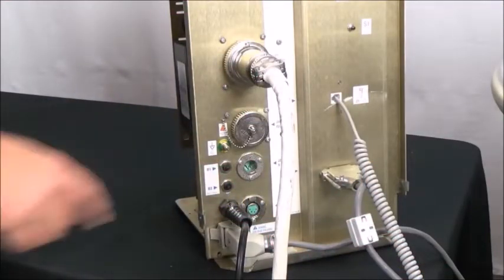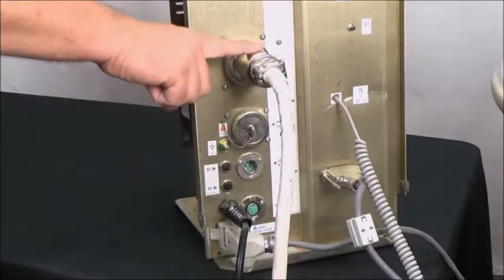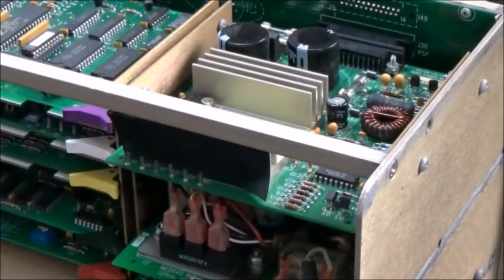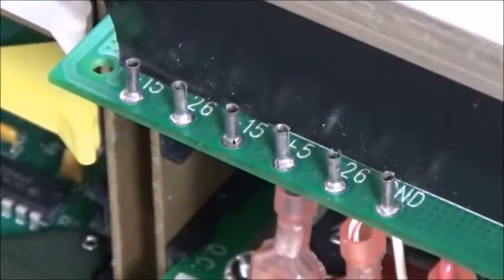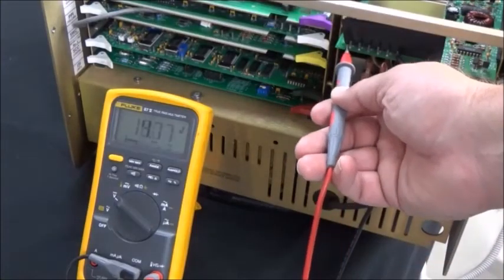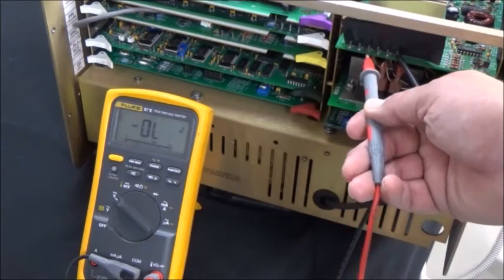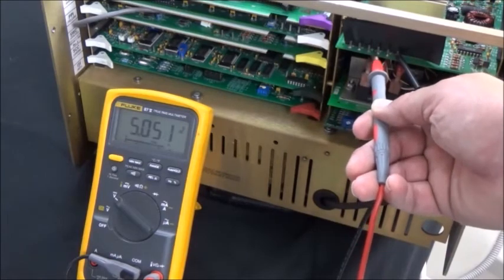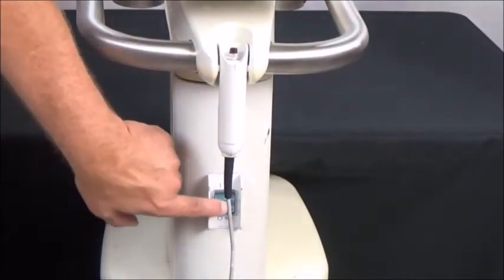Plug all the cables back in and turn the injector on. With your multimeter in DC mode, measure the 5 regulated DC voltages on the PSP board and verify they are within manufacturer's specifications. Be careful not to accidentally short one of the test pins to the heatsink behind them. If you wish, place some electrical tape on the heatsink for insulation. There are no adjustments to these measurements. If they are out, you must replace the PSP board. Turn off the injector.